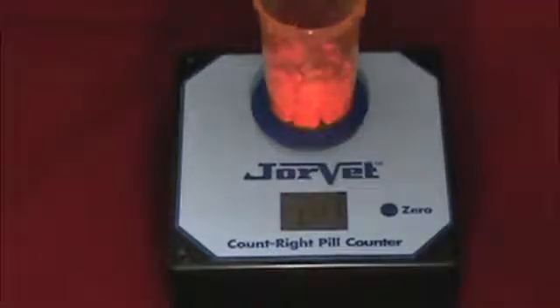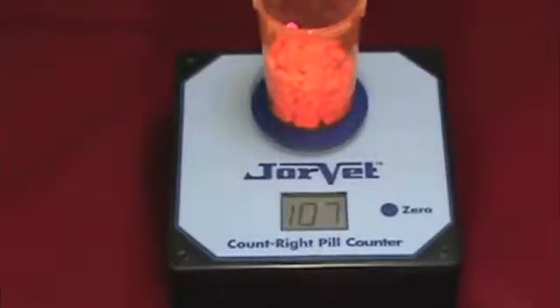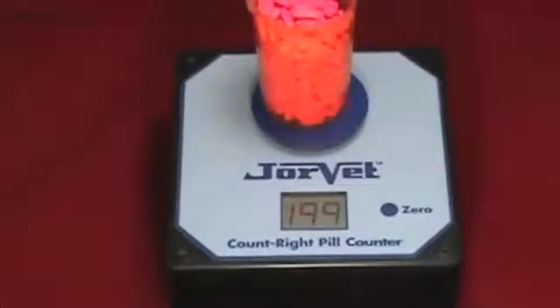The maximum number of pills that can be counted is one hundred and ninety-nine. If you attempt to add more, the display will show zero O-L for overload and you will have to pour some pills back.